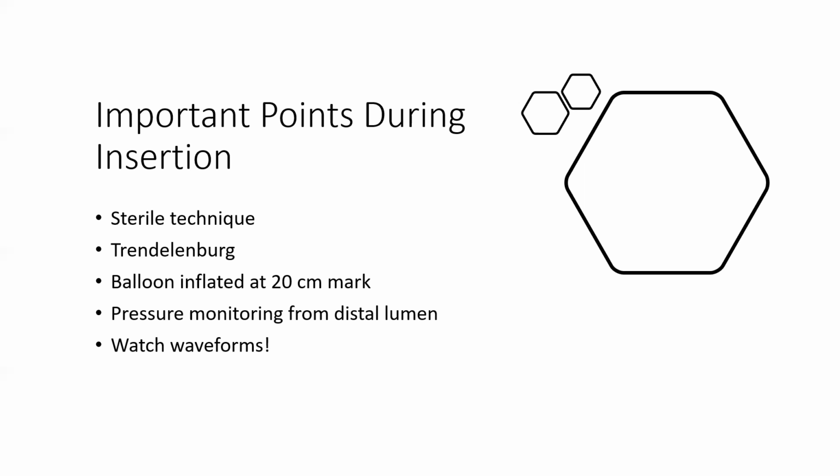Okay, so when the cardiologist inflates the balloon, it usually is very slow and controlled and never surpasses the 1.5 ml, which is the limit of the balloon.